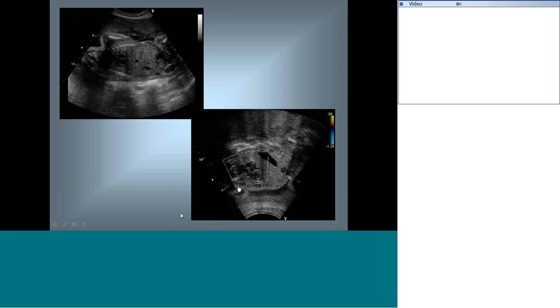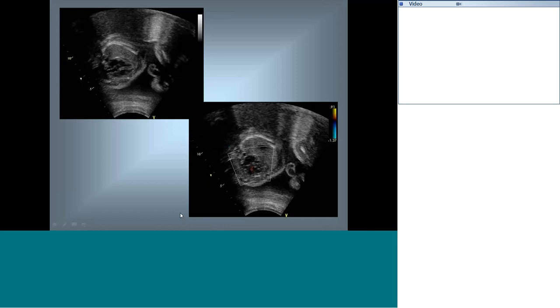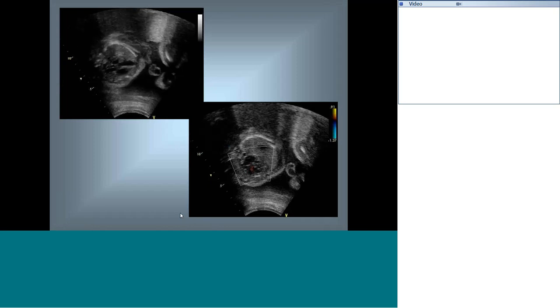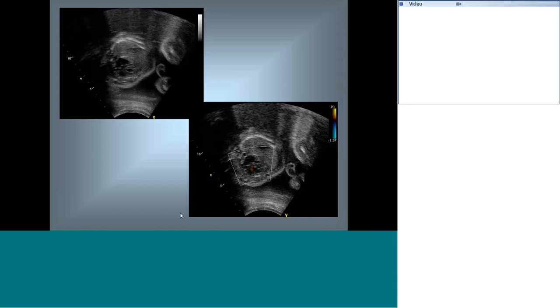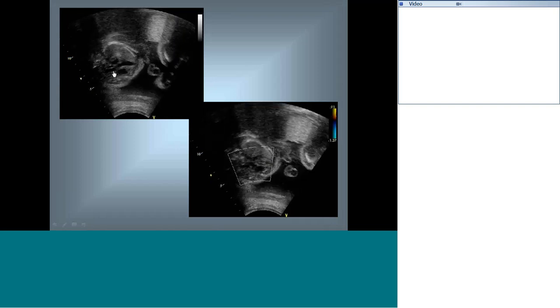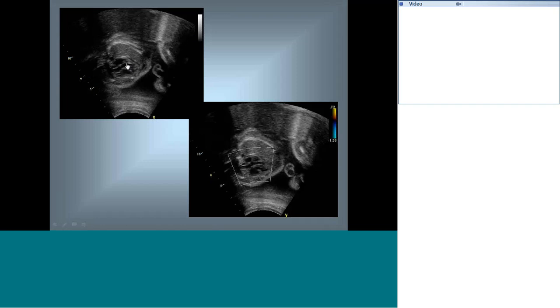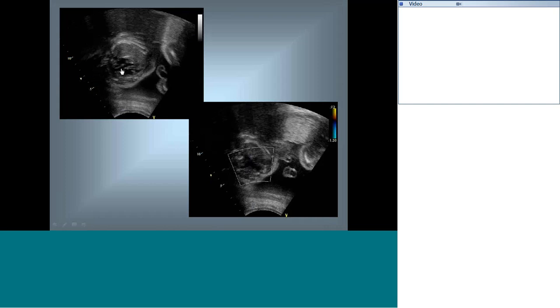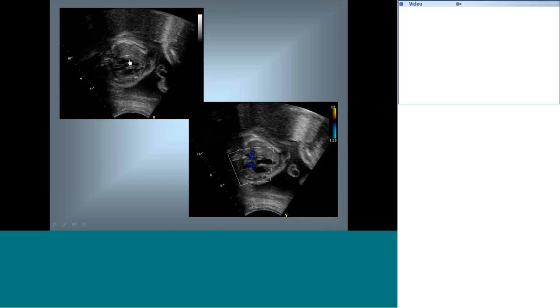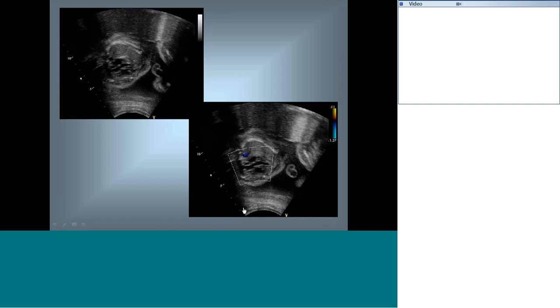From this view we go back to the four-chamber view and modify it to cut across the long axis of the heart. This gives a parasternal long axis-type view where we can see the LVOT in its length and mitral-to-aortic continuity. This view is important to confirm aortomitral continuity and also to look for VSD in the membranous subaortic area. The same can be checked on color.